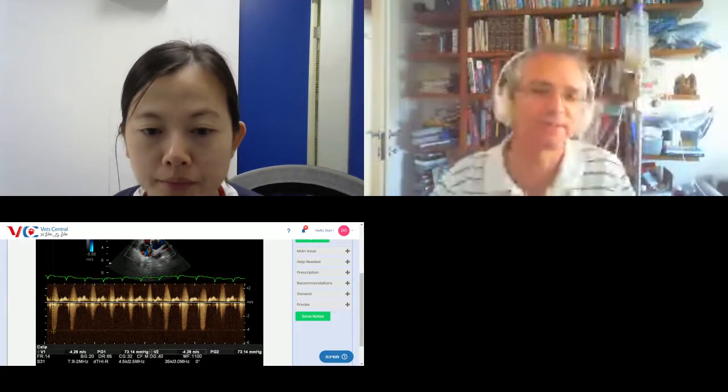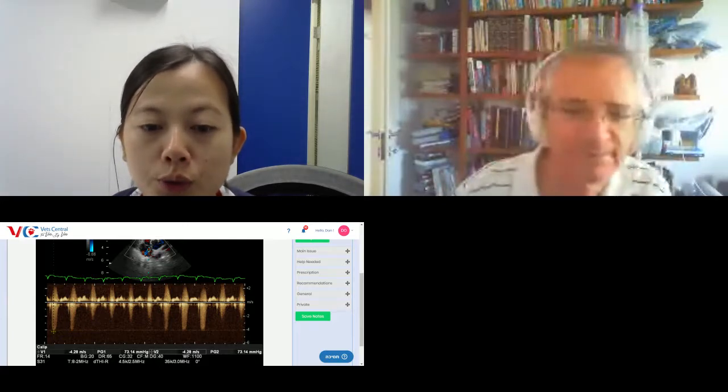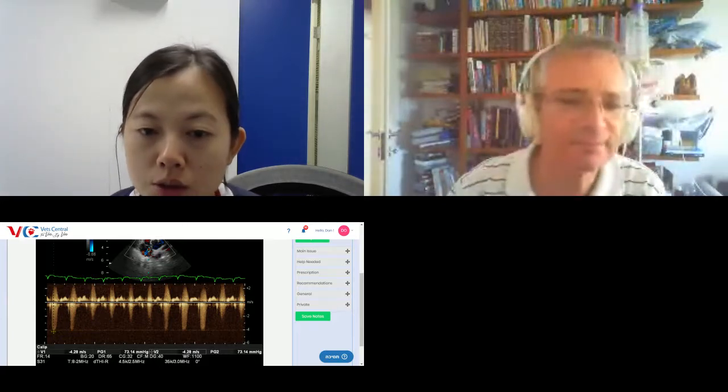Exactly right, yes. And for the x-rays of the chest, can you also give me some second opinion on the cause, maybe? I'm not really sure I can give you a certain assessment, but I think depending on the epidemiology in that area, there is a common lung disease or upper airway disease, which you may be familiar with, especially given that specific signalment and region.